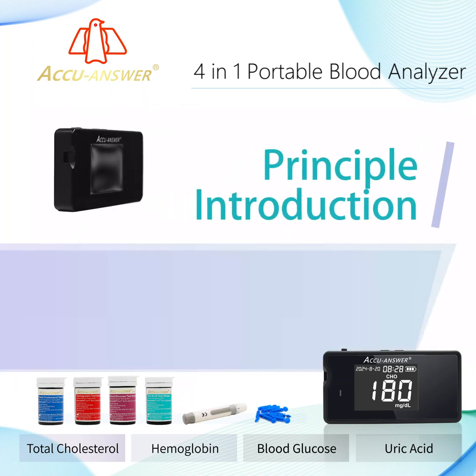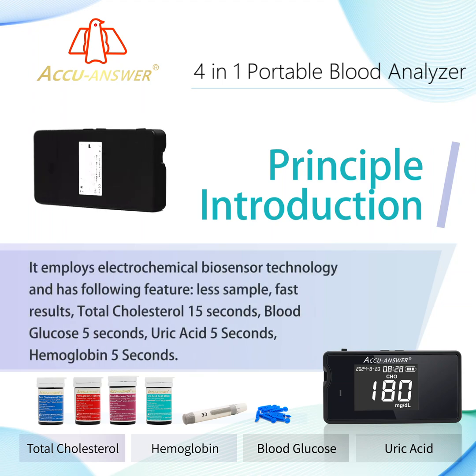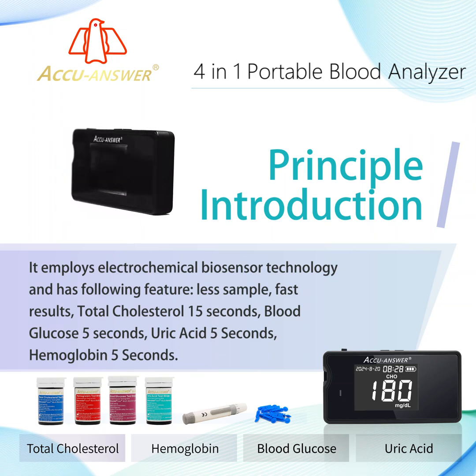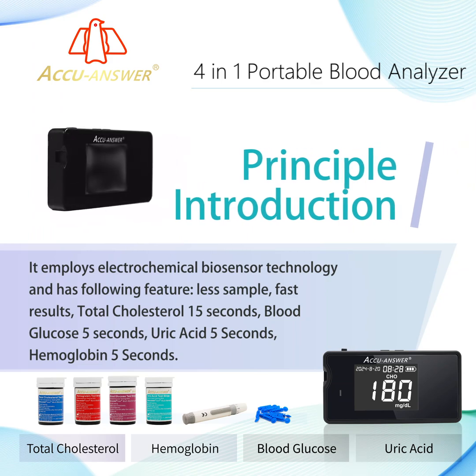Principal Introduction: It employs electrochemical biosensor technology and has the following features — less sample, fast results. Total cholesterol: 15 seconds. Blood glucose: 5 seconds. Uric acid: 5 seconds. Hemoglobin: 5 seconds.